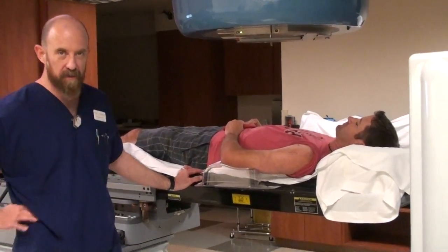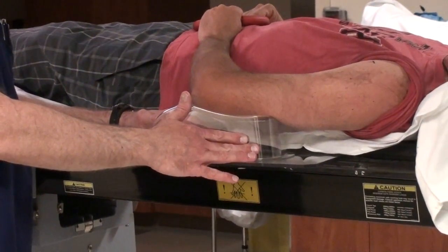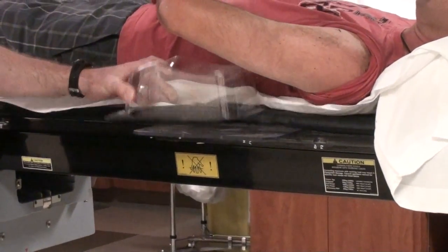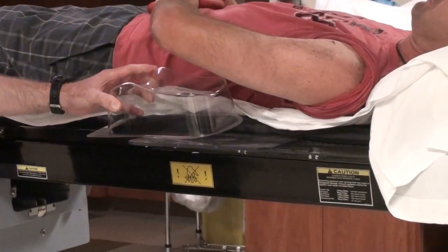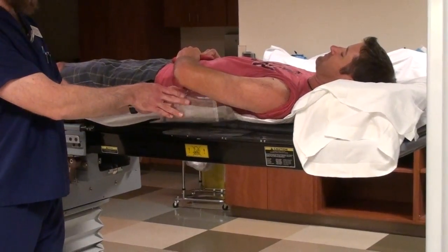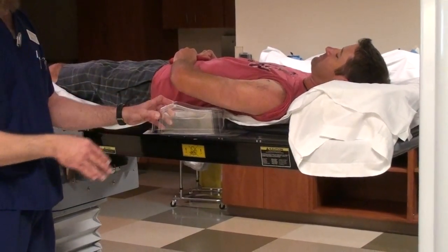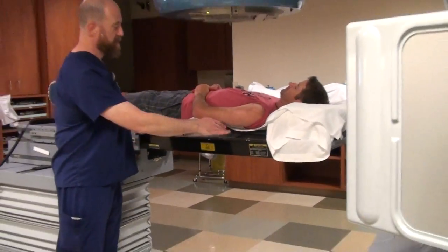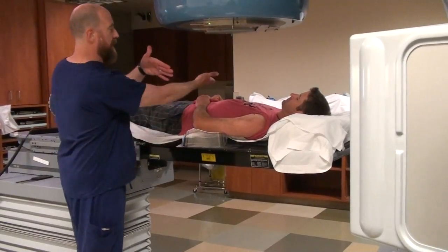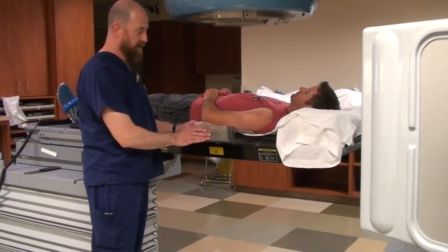If you've been kind to your patient or they're in pain and you've given them a table pad, make sure that the headrest is completely on or completely off the table pad. You don't want it partially on and partially off, because every time you try to adjust the patient the table pad will cause the headrest to sit in a different location and it's going to be wobbly. You want reproducible and stable. Either use an extension or move the table pad completely to the side so you have access to the table itself, giving you a nice stable setup.